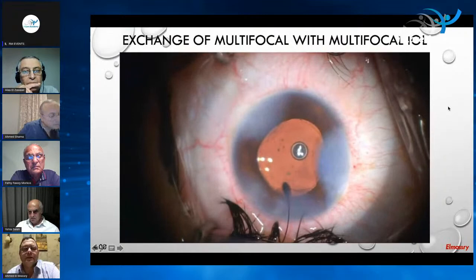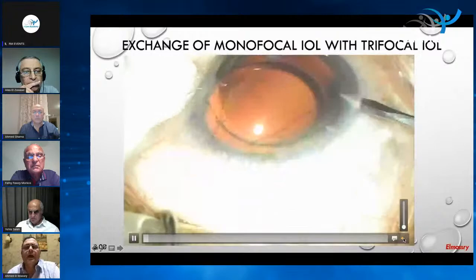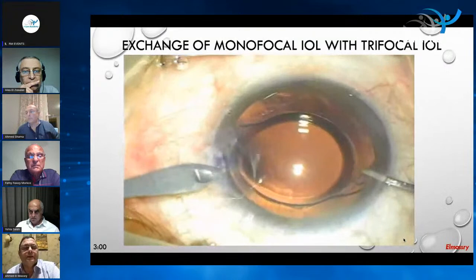The monofocal Technis one IOL had been in for 6 months. This is the last video, and as you see here, this is a not very common situation. I think it was my first case to do it.